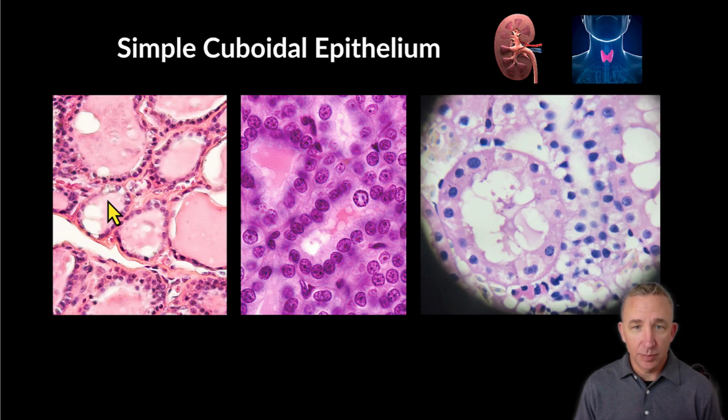So when I look at this part of it, we're looking at a follicle, but all these cells that wrap around here, individual cells, and I can see that based on the nuclei, are simple cuboidal epithelium. If I expand on this, it makes it a little bit easier. Remember, to me, I said they kind of look like pearl necklaces, but I can see those nice round nuclei.